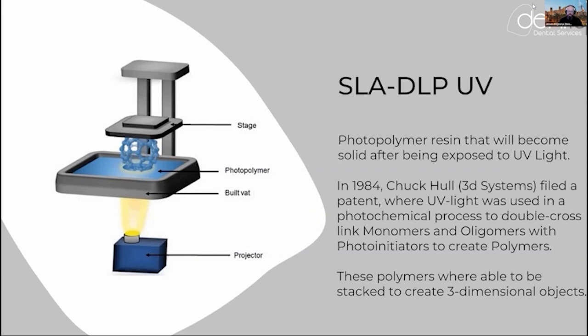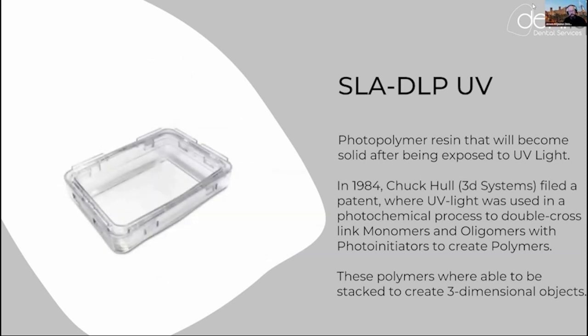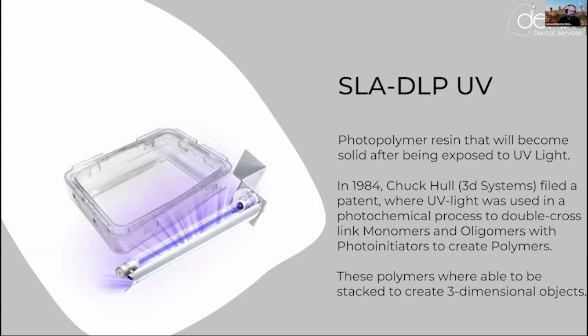He really invented this system, and look at what we do nowadays still with it. We're absolutely amazed what the options are. And like I said, we got a platform. That platform has a transparent bottom, by the way, in this case. That is like, I always like to call it a Teflon. Underneath is a UV light, and that solidifies.